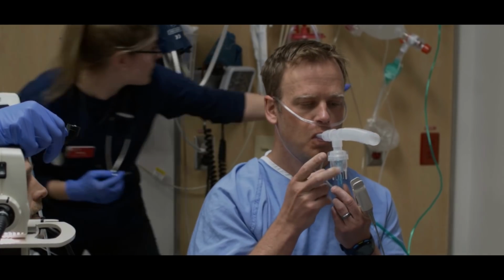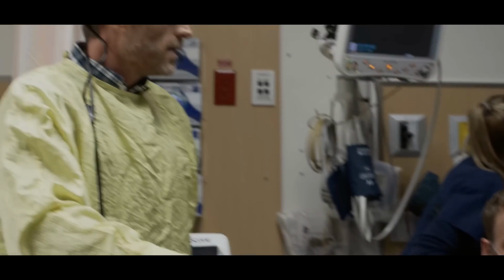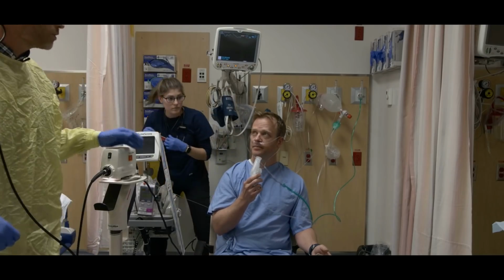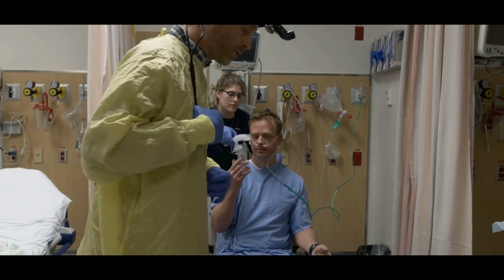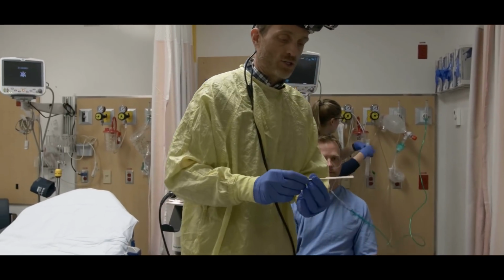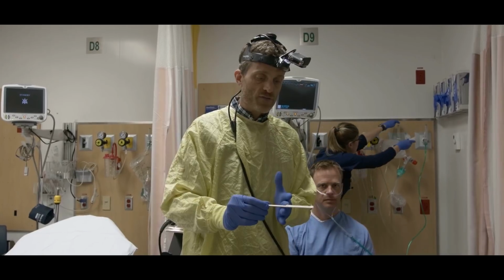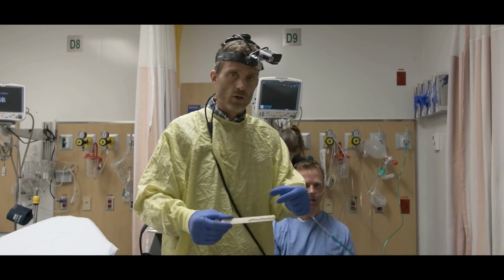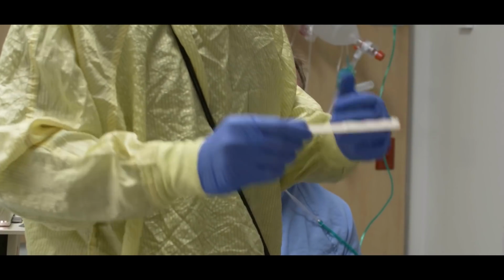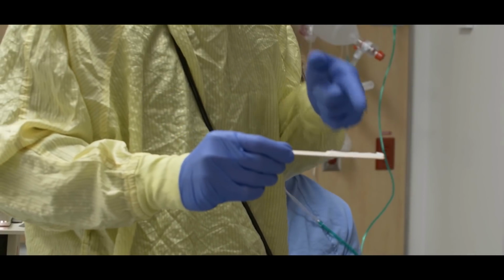Okay. And I'm interested, Chad, are you feeling any numbness anywhere in your oral cavity? I think so, yeah. A little bit, yeah? Okay. So next up, we're going to do 5% ointment. We have a tongue depressor here. This is a 6-inch tongue depressor. So half of the tongue depressor, 3 inches, single line of the 5% ointment. This is 1.6 grams, and when you do the math, that's 80 milligrams of lidocaine. So that is 80 milligrams of lidocaine right there.